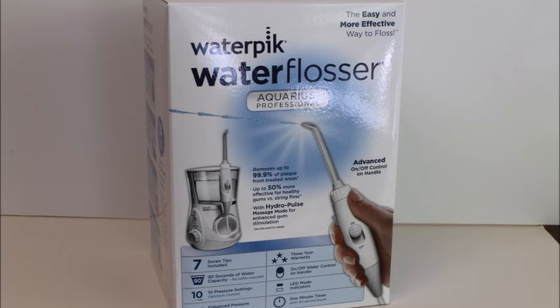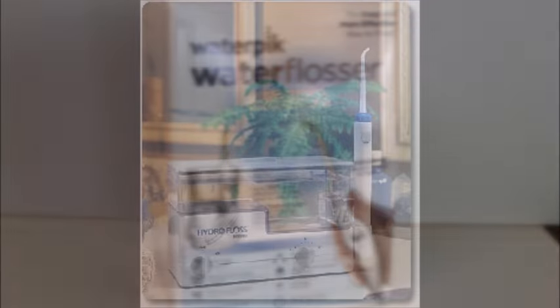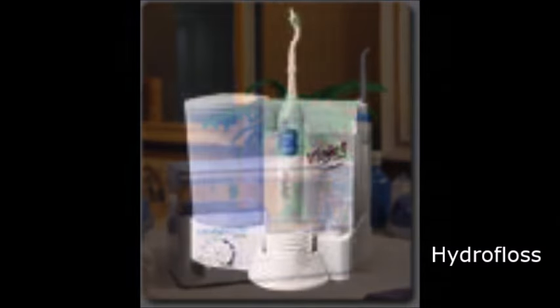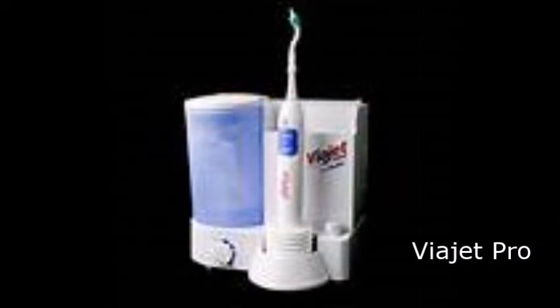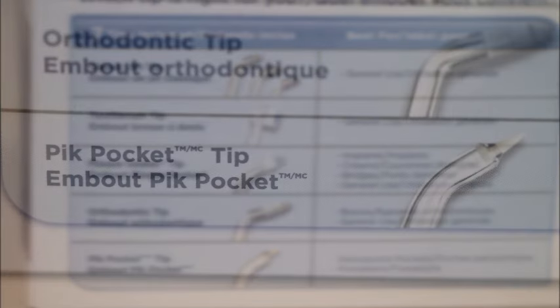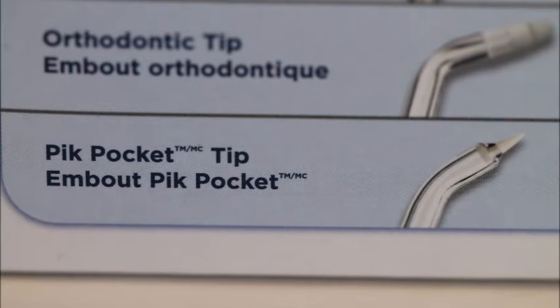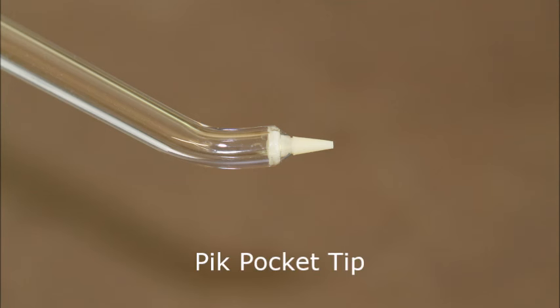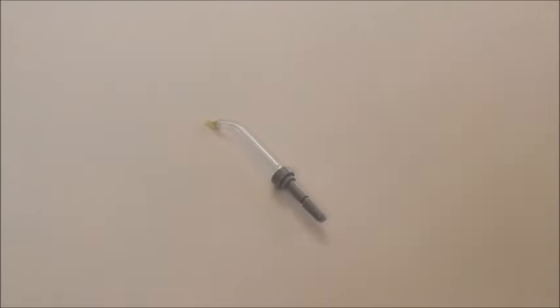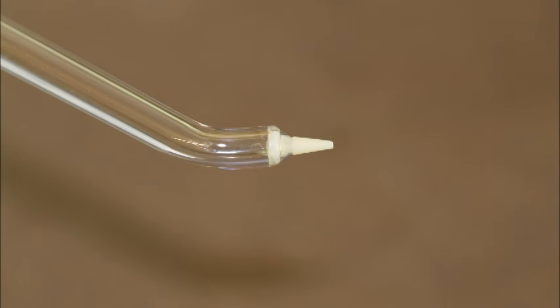This is a Waterpik Aquarius model. As of the making of this video, this is the model we recommend in our office. There are other devices that also work well, such as Hydrofloss and ViaJet. The important thing is to use the correct tip and the correct technique, and to take the time to do it right. With the Waterpik, the tip you will use is the pickpocket tip. All of the other tips that come with the unit can just be set aside. If you're using a ViaJet or Hydrofloss, use the tip that's most like this pickpocket tip.